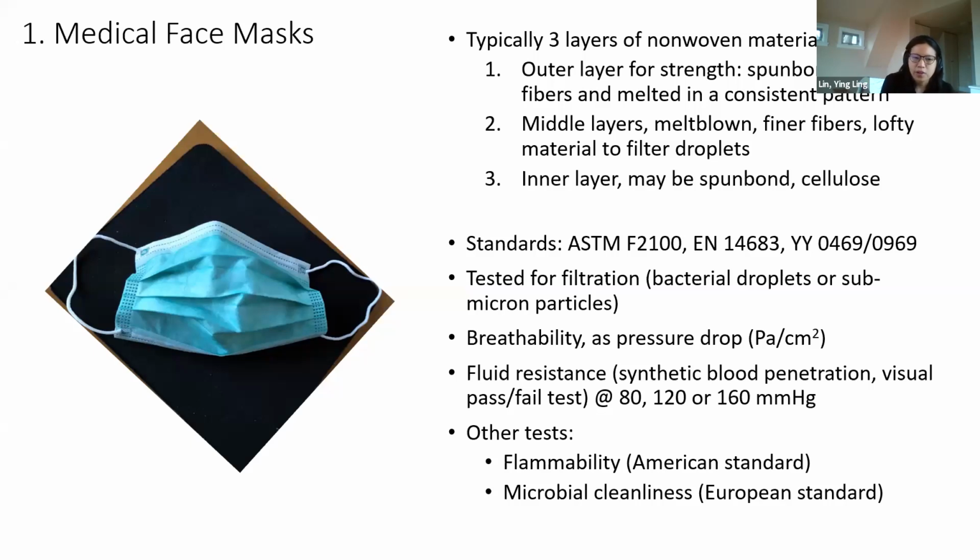So that's actually very critical, just because if you get too much of a barrier from the front of the mask, then because of the structure of it, the leaks around the nose and the mouth and the cheeks, that's where your unfiltered air will go out or go in. And the primary design of these masks is for source control. So in surgery, you'd have the surgeon look over the open cavity, depending on the surgery, and it would catch the droplets that go into the patient. So that's really the design and intent of this kind of mask.